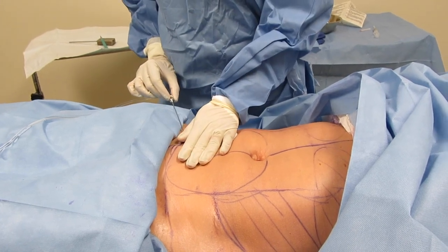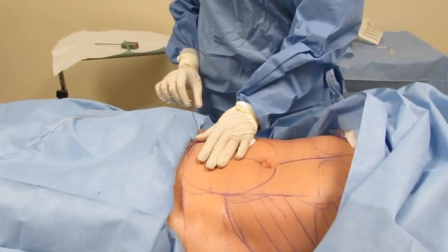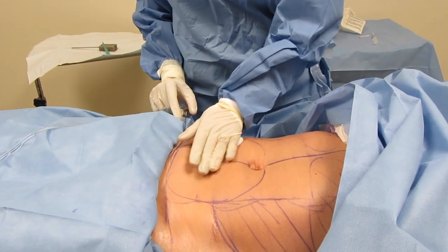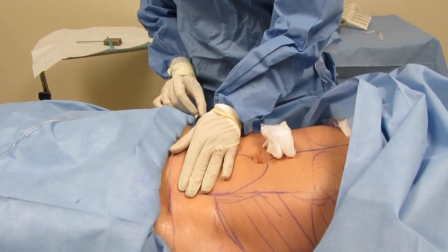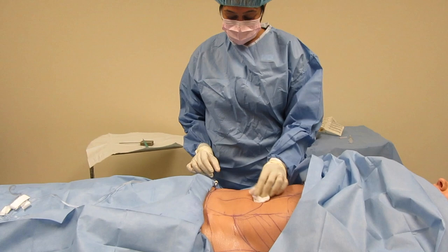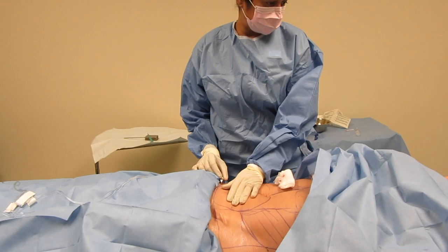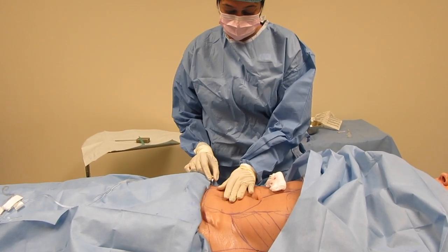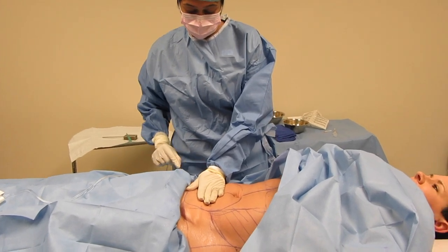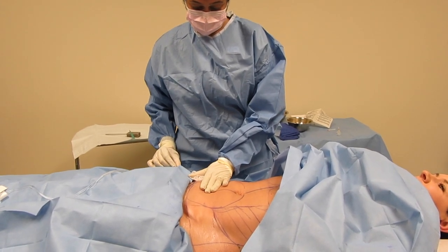This is a tiny cannula, and through this we are going to infuse the tumescent fluid. That feels weird. I'm going to slowly infuse this fluid. The nice thing is it's got lidocaine in it, so in a second or two of the fluid going in, it numbs you. It's not too bad, is it? Good. No, it kind of tickles. So, if you see, Nikki is quite comfortable. I never felt any pain.